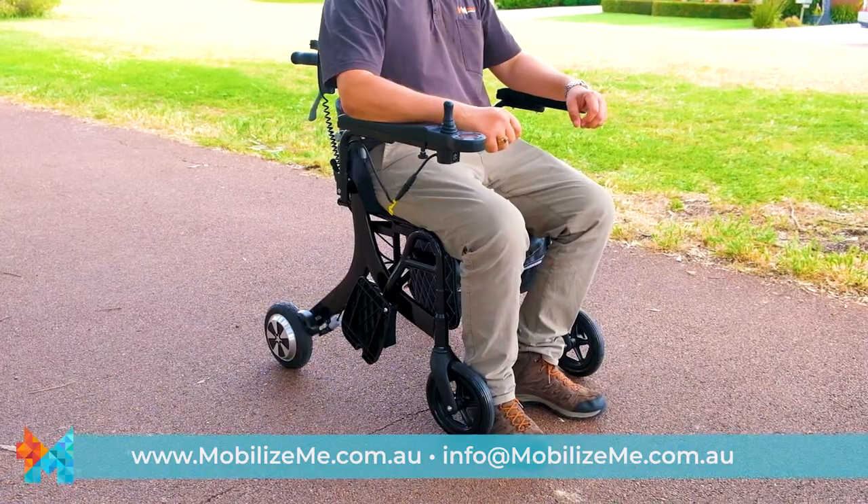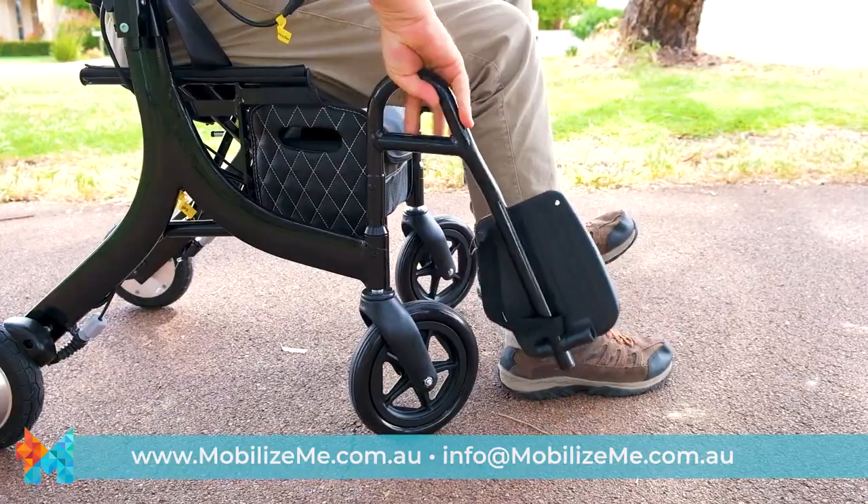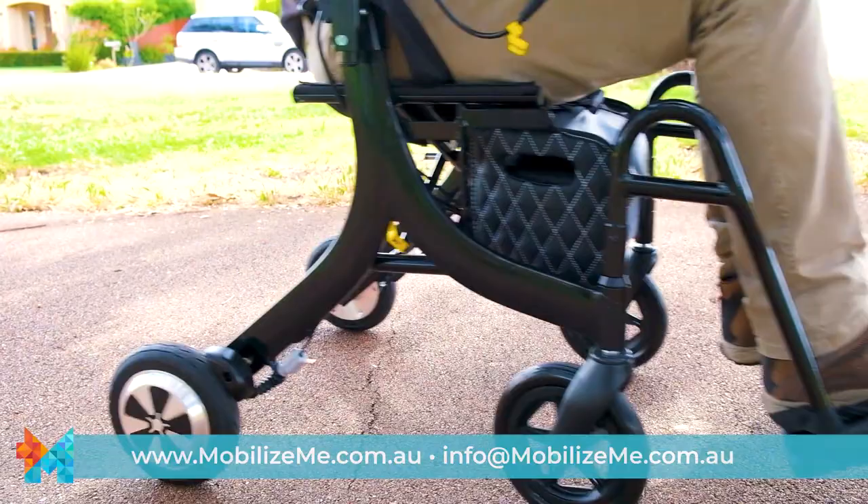This is done by lifting them up and then swinging them to the front until they click in. The footplates can easily be folded down using your feet or by reaching down.